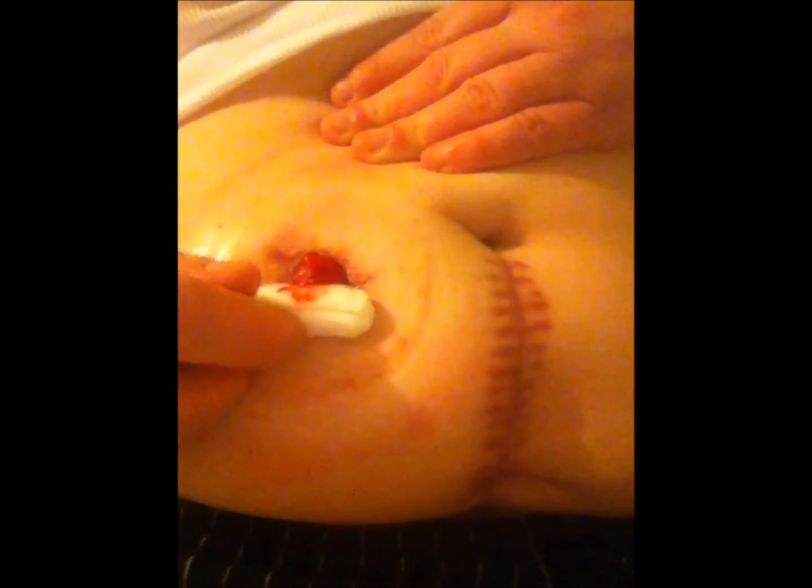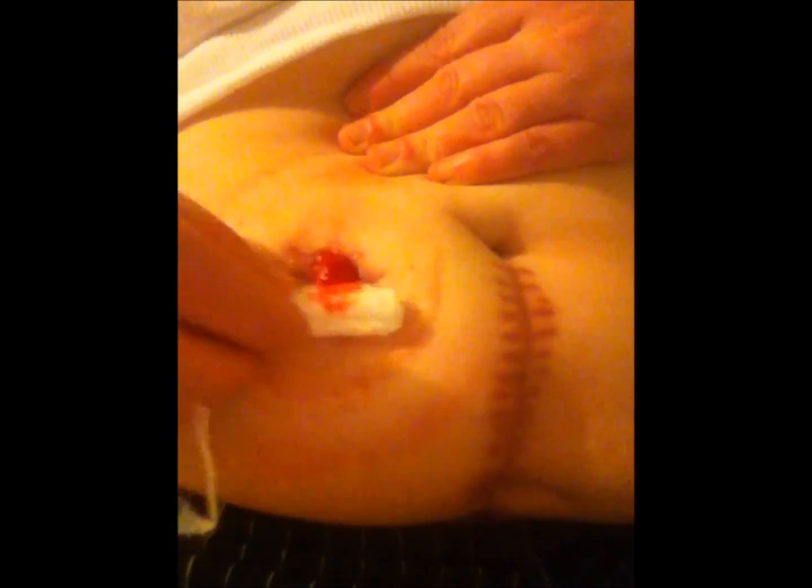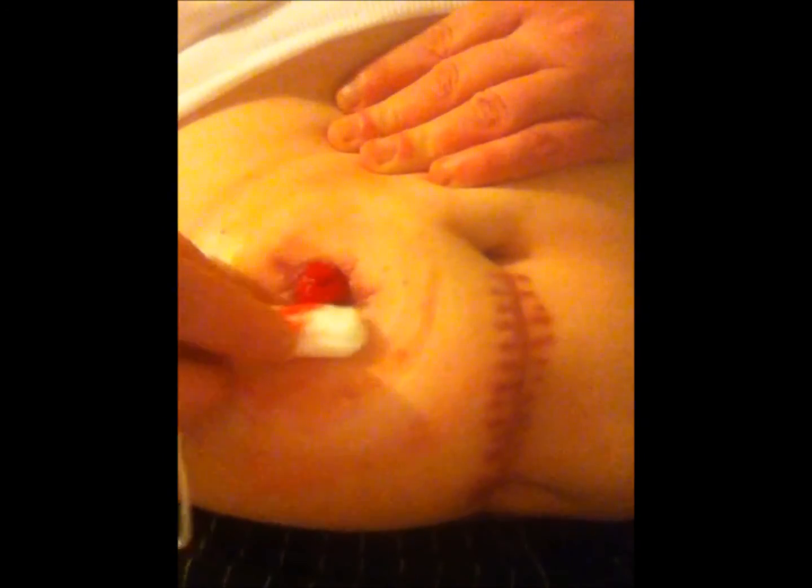So the first thing I do is, they say not to use soap, but I just have to do something about that itchy feeling that I get from the adhesive. So I wash it, and like I said, it doesn't hurt. I just took a shower anyways, but I didn't take it off, so I'm going to wash this anyways and really get that feeling good. Now see, it's bleeding, but don't worry about that. That is not harming me a bit, and it's just absolutely natural for that to happen.